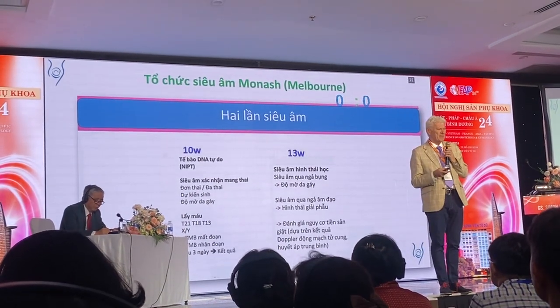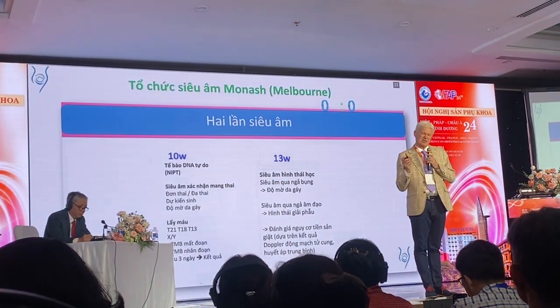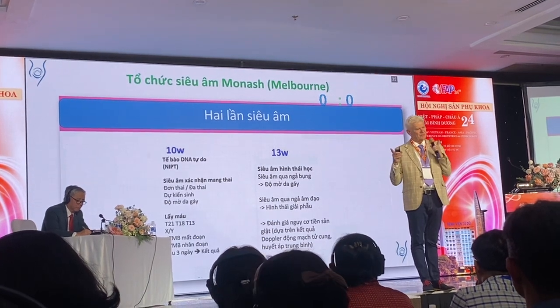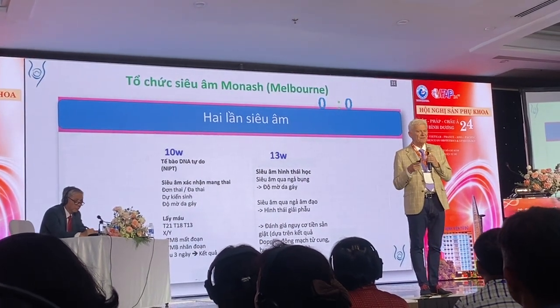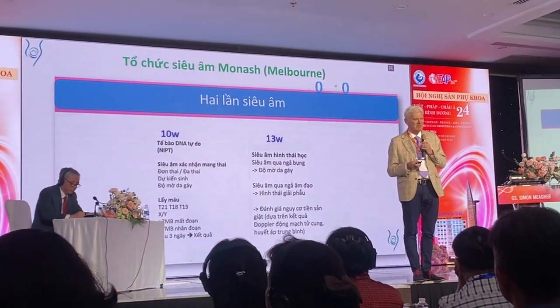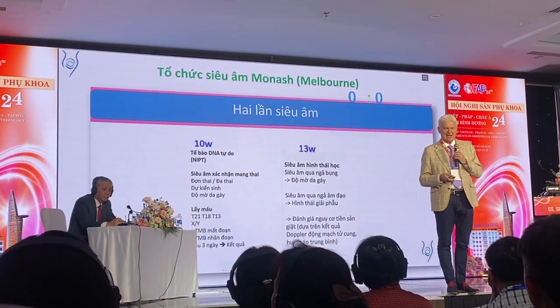And you know what the biggest advantage is of doing this? We can precisely time the first trimester scan at 13 weeks of gestation. We do not do a scan at 11 to 14 weeks anymore. 11 to 14 weeks was for the nuchal translucency. But cell-free DNA is a better test than nuchal translucency for Down syndrome and the other chromosome abnormalities. So if that is the case, why do an anatomy scan at 11 weeks?